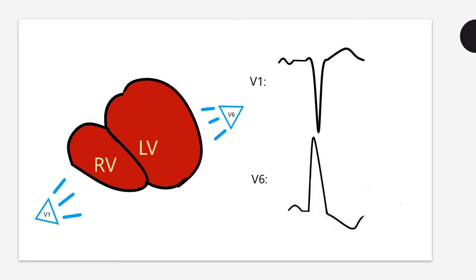And again, as stated, anytime you have an abnormal depolarization, you're going to have a flipped T wave. So you will see flipped, downward T waves in V5, V6, 1, and aVL. Those are all the leads that look at that left lateral wall.